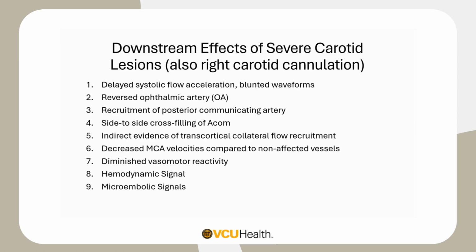You're doing it as a life-saving measure, but you're trying to rely on extracranial as well as cross-collateral flow to be able to provide sufficient circulation to that right hemisphere. However, the risk of injury in these situations is quite high, particularly to the right hemisphere. Now, we know in adults with transcranial Doppler ultrasound that we can use a variety of different characteristics to recognize when there is a severe carotid lesion.